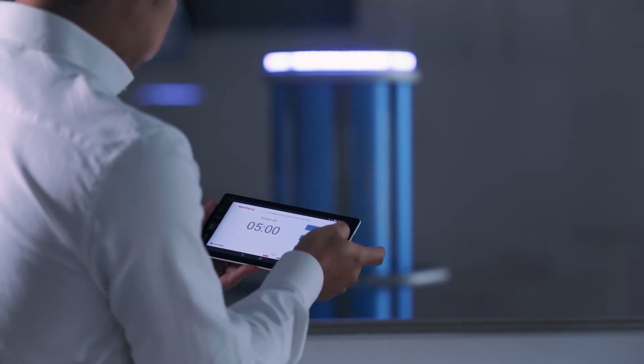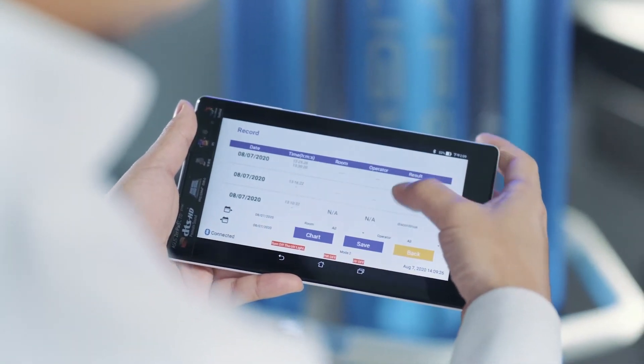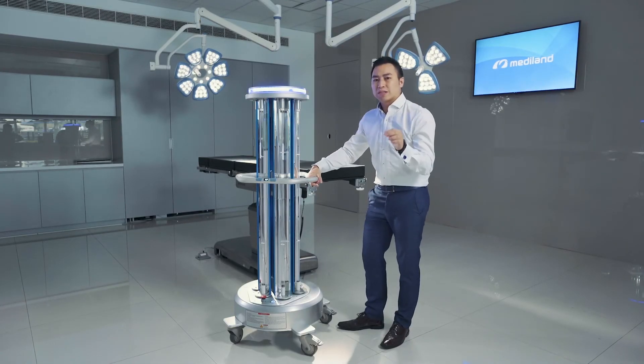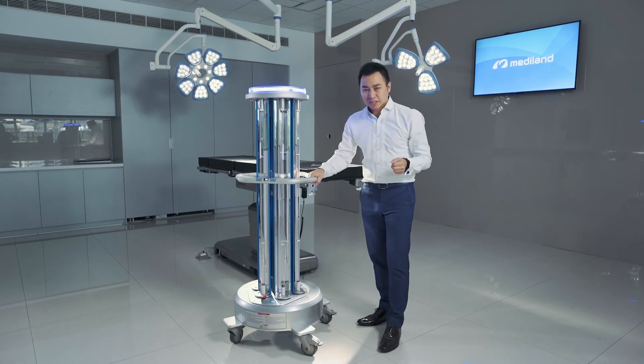We can use the tablet to control this device and record whether it works or not — everything is recorded after use. We can also provide all the test reports and clinical reports from hospitals to prove it works. Thank you for your attention.